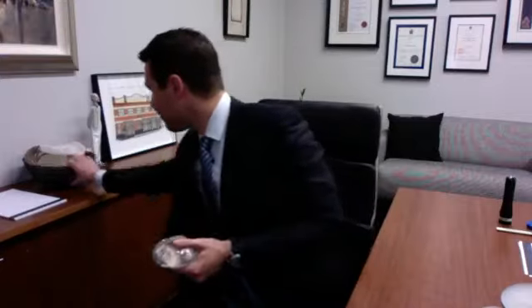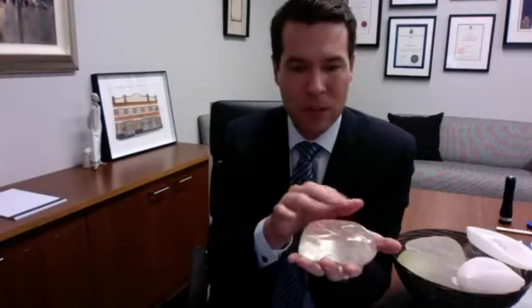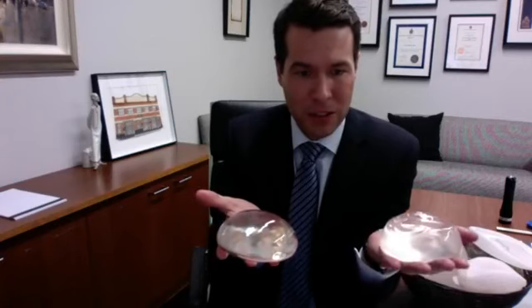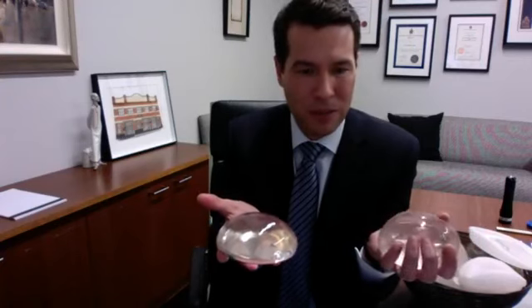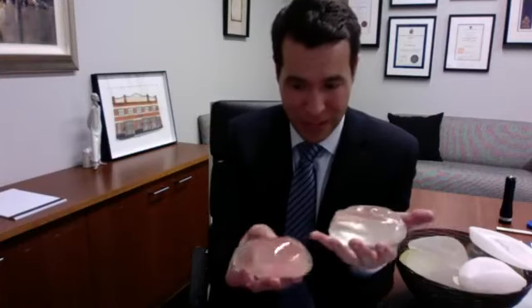The other implant that we've got, which is new, is called the Memory Gel Extra from Mentor. It is a smooth surface implant. If we look at other implants, and I've got my fruit bowl of implants, which my trainees think is hilarious. But if we look at a traditional smooth implant, let's see if that lines up. You can see how the fill of that, the shell is not actually as full as this one here. So you can see that the Co1 traditional smooth implant from Mentor is sort of underfilled. The new Memory Gel Extra has got a greater content of silicone within the actual implant, so it doesn't have that emptiness.